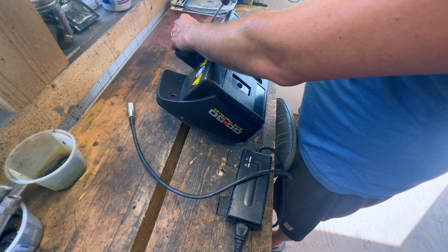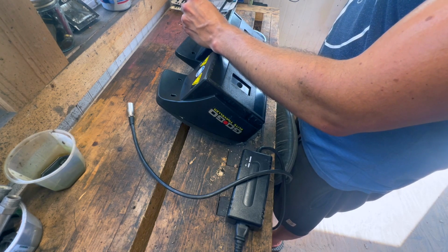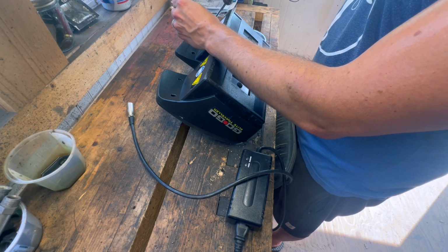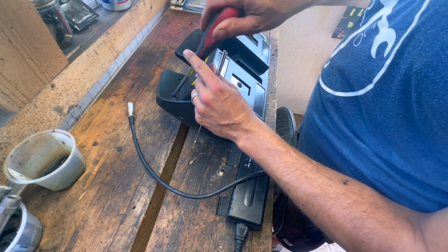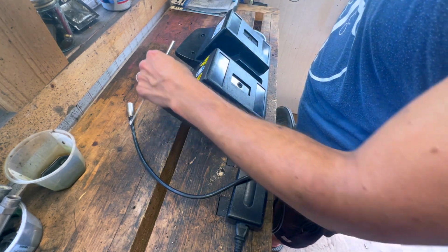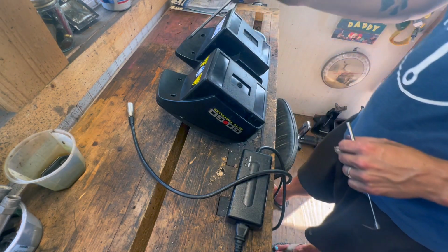So there are a couple screws missing already. If that's an indication of what's going on. Like I said, just because they were flopping around in there, made me think that perhaps something's just disconnected. More than likely, they're just shot. I don't know why I can't get that out. Maybe it's got some kind of a retainer or a nut on the back side. That one comes out. There we go. So those two were missing.